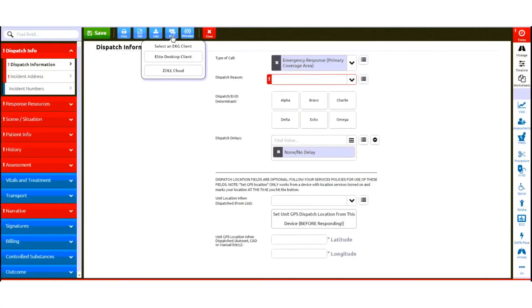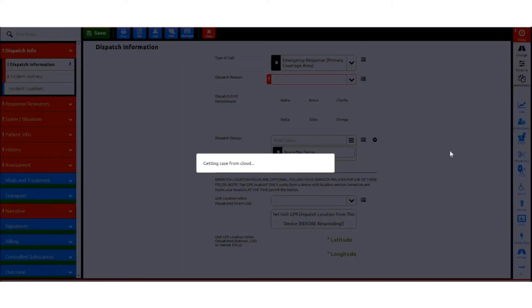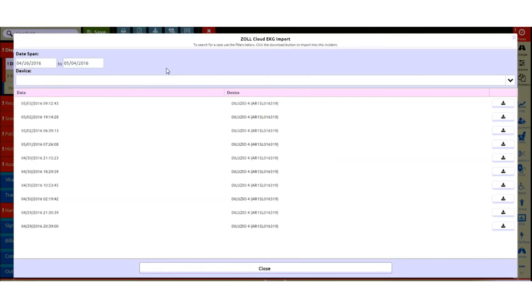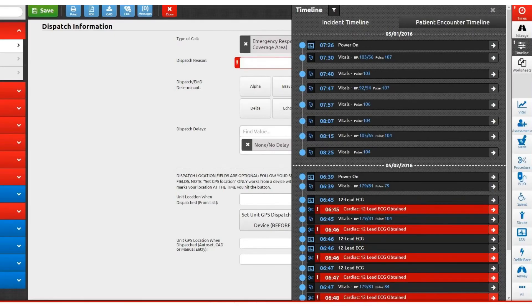If you're using the ImageTrend Elite program for your patient care reporting, once you open a new patient care report, across the top you'll see EKG, and then select Zoll Cloud. There will be a message that appears saying getting case from cloud. The available case files will then be listed by the date and time the call occurred and the device that was used to run the call. Select which call you'd like, then click the download icon on the far right-hand side. You'll then see a list of all the information that was uploaded from the X-Series, which will help you complete your report, and at that point the process has been completed.